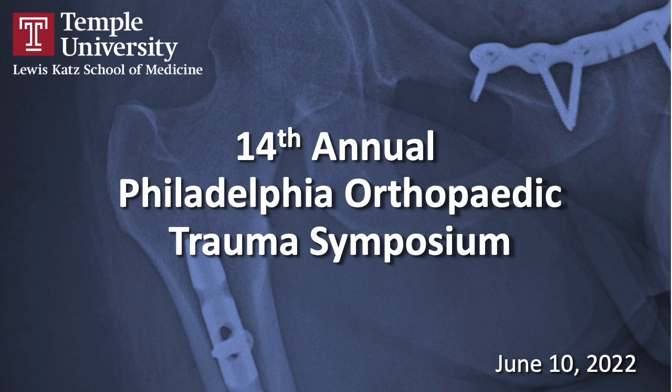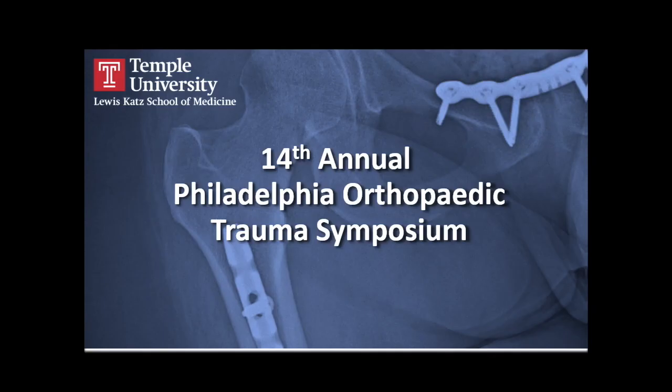Matt, we'll start with you. I'm going to ask the same question to everybody, so get ready for your answer. Thank you for sending the patient to me. First of all, I have no problem in that situation. If I totally don't like it, we go to the OR, we take the pins out, put pins where I like them, and then we wait. So I let that old pin site defervesce and clear up and let the swelling go down. If I love it, it's perfect, thank you, I don't change anything.